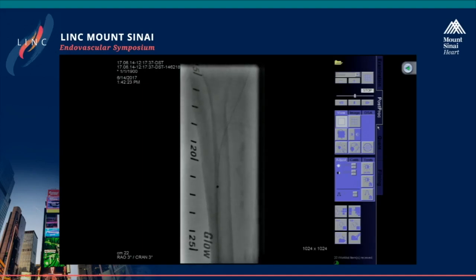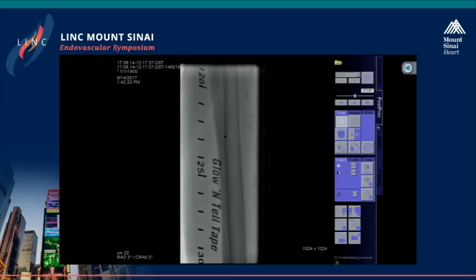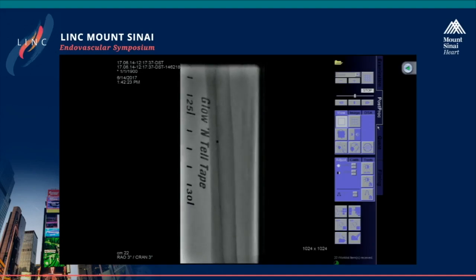Dirk, any tips from the panel on what fluency and rate you normally start with in these laser procedures? Any comments? I usually start at 45 and increase by about 20 each time. You're running about 3 passes before shooting a picture. I couldn't hear him. I typically start at 45 and then bump up to 65, all the way to 80 with the 0.9. Basically several passes and then you reassess.